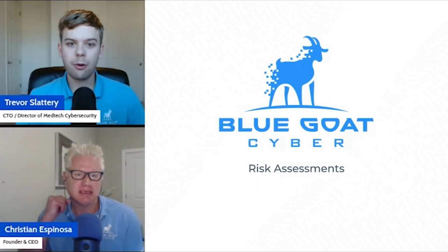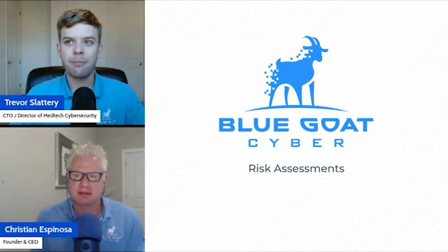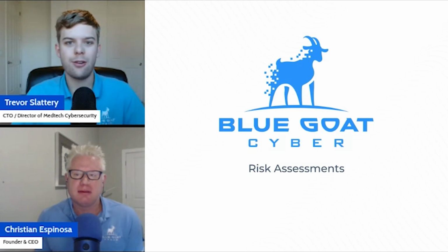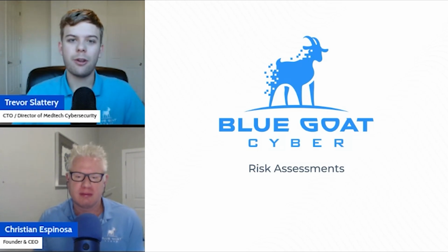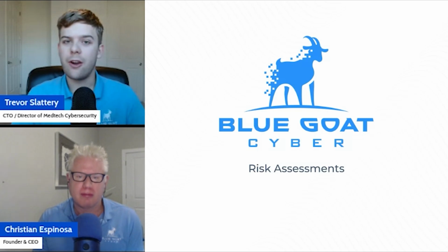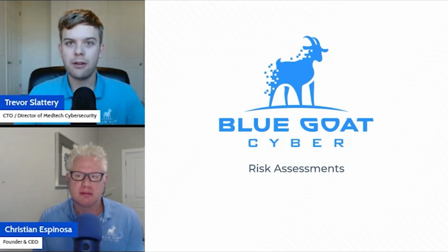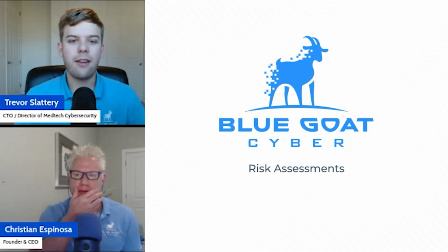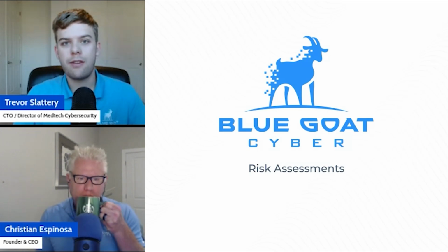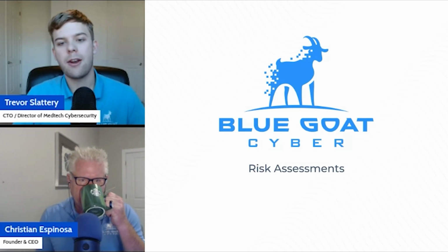So, like you mentioned, we're going to be going over risk assessments. Before we get into what the process is, especially when relating to a medical device, we'll talk about how this ties into risk management. When we're looking at the overall risk management process, risk assessment is a single part of that. It's a very complex part and a very important part. What we're trying to do is identify a problem and evaluate what the actual outcome can be, what the impact is, and what needs to be done about it.